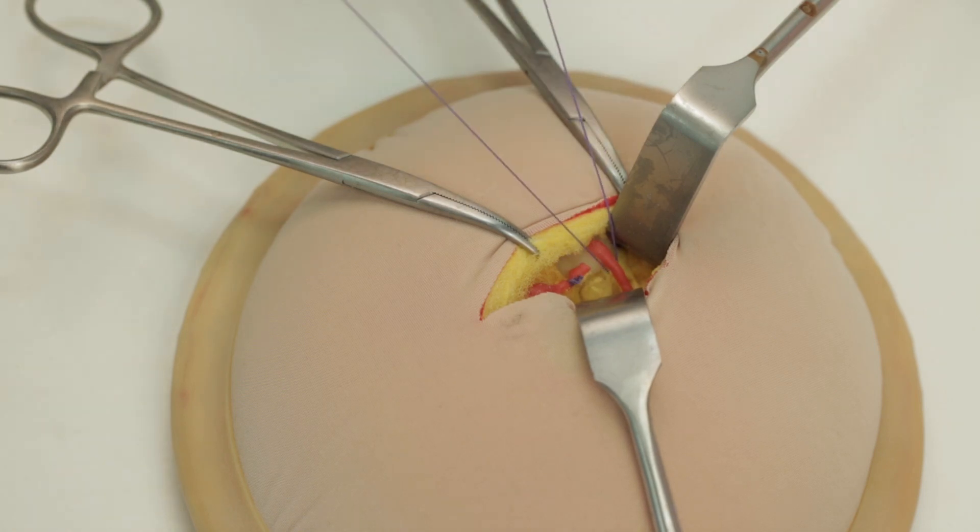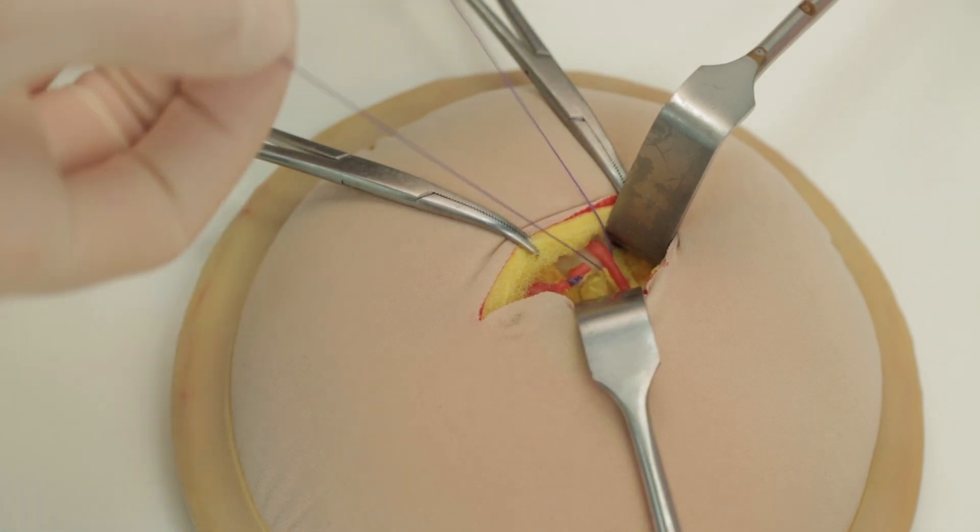Remember to take your knots down towards the lesion, rather than tugging up on the blood vessel.